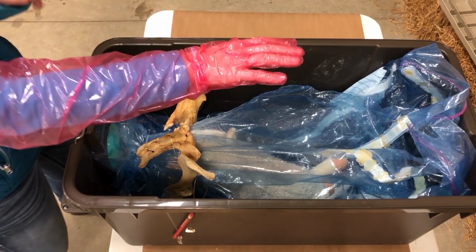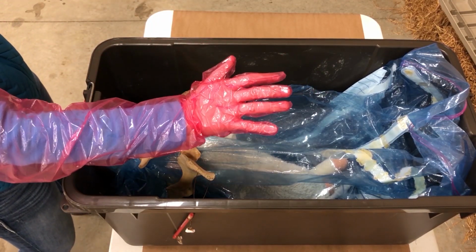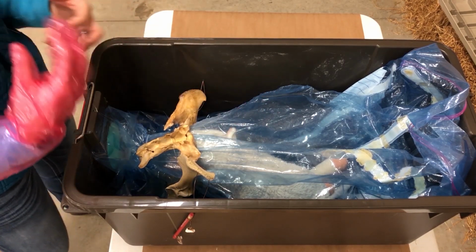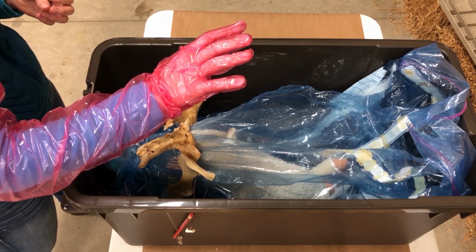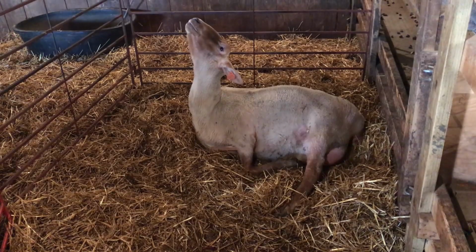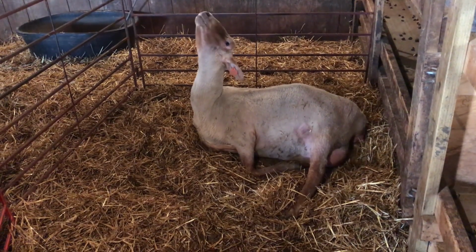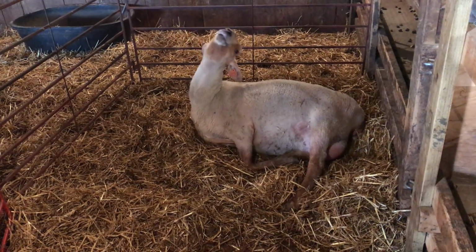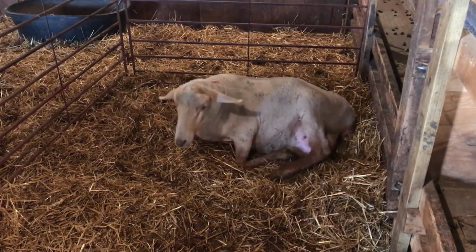It's very warm inside the animal and it might be very cold outside, so you as a human also have that stress on you. So when you're working with the ewe, if you're pushing back in, go ahead and do that when she is not pushing. Once again, much easier said than done, but try to do it when she's not having a contraction. And the same goes for the opposite. When she is pushing, that's when you ought to be pulling, if that is an option for you.